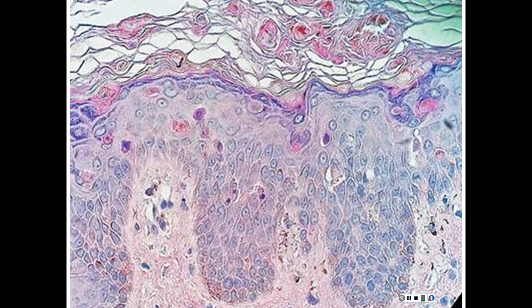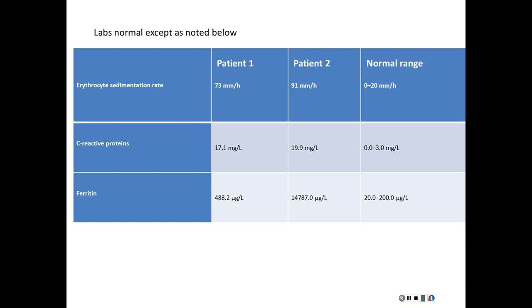So again, Still's goes through life phases, and you have to recognize each phase. So there's the acute neutrophilic phase, looks kind of like urticaria, in that it has no karyorrhectic debris. Differs from vasculitis in that there's usually very little karyorrhectic debris. And then the dyskeratotic cell phase, and then they pop out into the corneum. So I would think Still's for that.